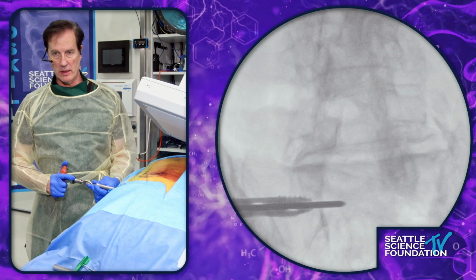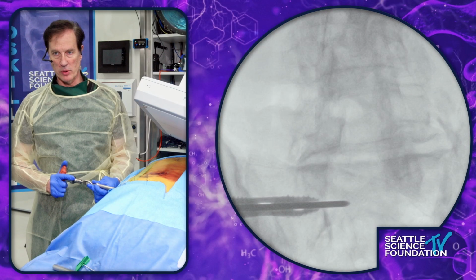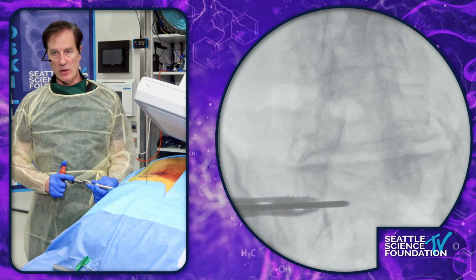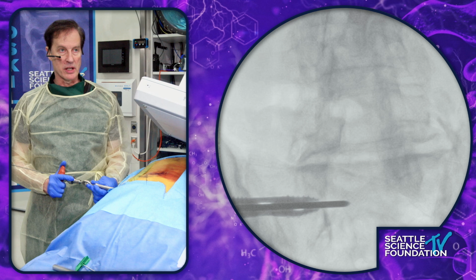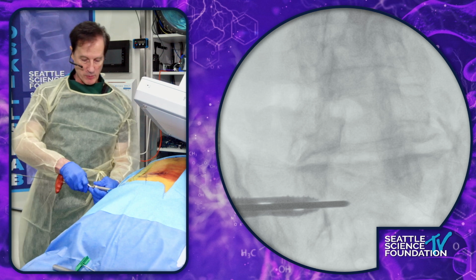Picture that. So that is flush with the posterior margin of the ilium. And keep in mind, you don't have to worry about the distal throw. We measured the size of the implant, so we know exactly how long that implant is, and it should fit perfectly. And it is in this case, but let's say you missized this and you need to go a little farther. There's a bone corridor there that you know you're not going to hit anything. It's all the way through, and we have it perfectly lined up.